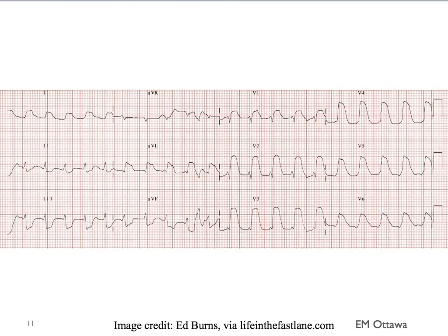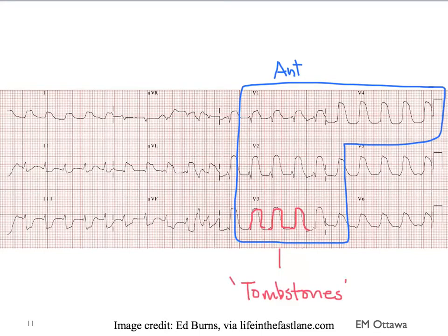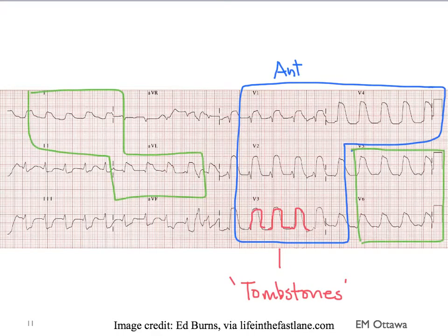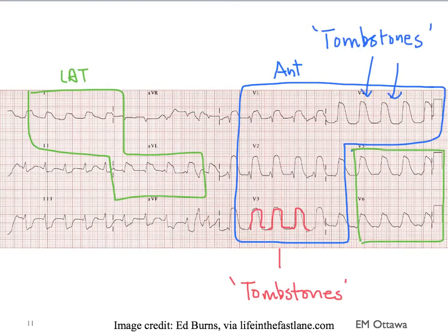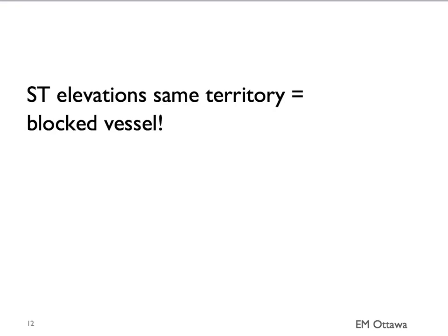What about this ECG? Just look at the ST elevations and decide whether they belong to the same territories. There are ST elevations in multiple leads — you see them in the anterior portion of the heart. Pay special attention to the way the ST elevations look in the anterior leads: they have those rounded tops. These are also known as tombstones and are particularly worrisome for infarcts. Where else do you see ST elevations? You see them in the lateral leads as well, with tombstones there too. This is an acute anterolateral ST elevation MI. Every time you see ST elevations belonging to the same territory, you have to think there is a blocked vessel and therefore there is an infarction.